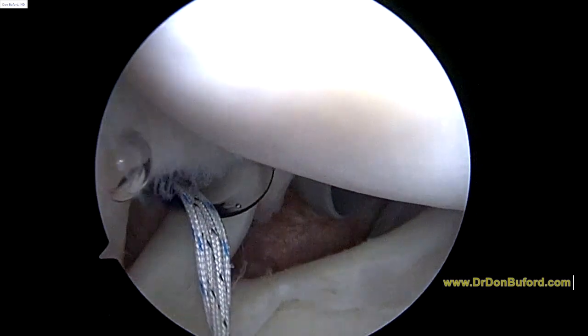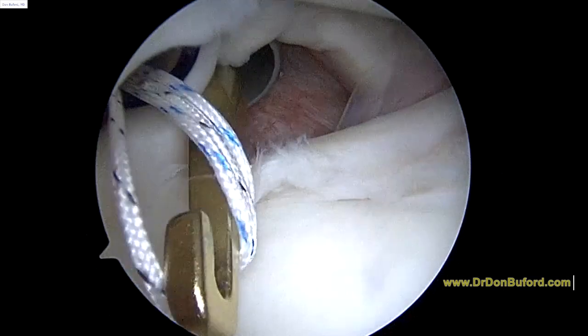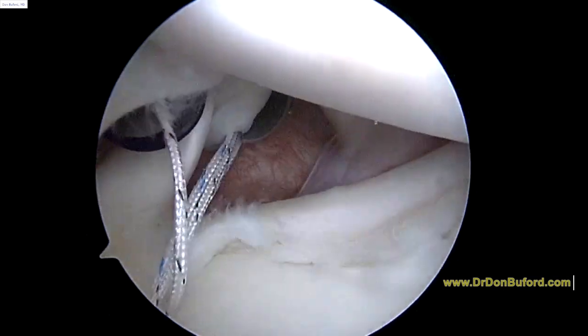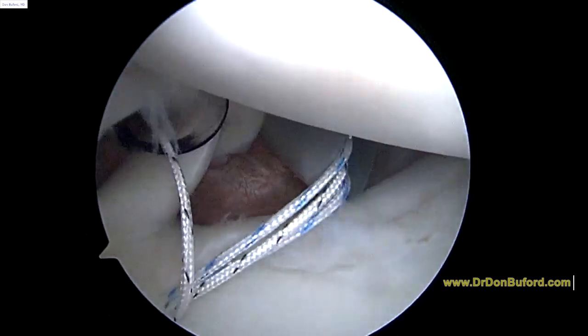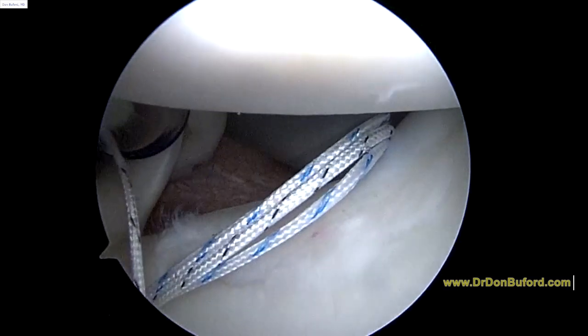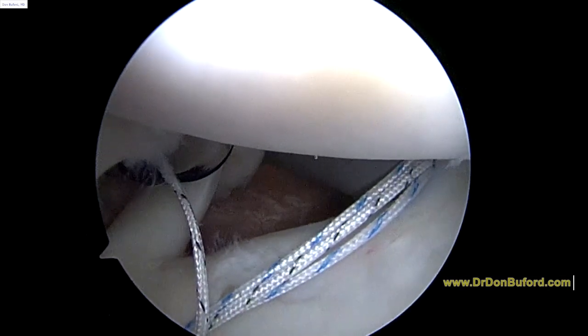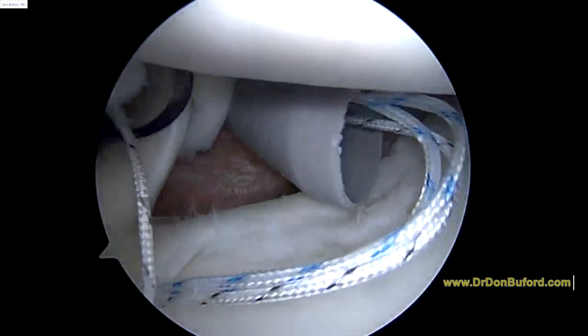We're going to take a crochet hook, and the way that we're going to fix this for you today, we're going to take three of these sutures out of the way first. So we'll take these three. We'll take them outside this cannula over a switching stick. Switching stick, big one. And we'll look at that.